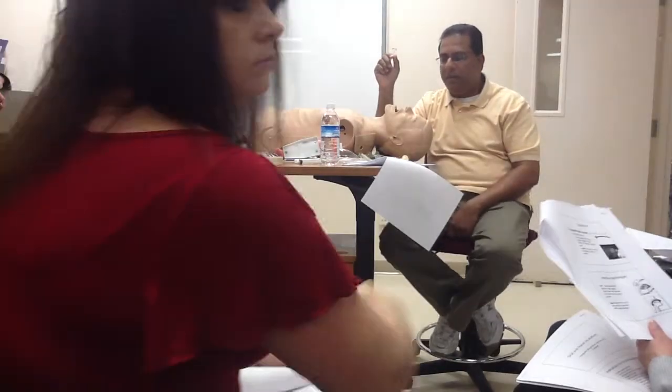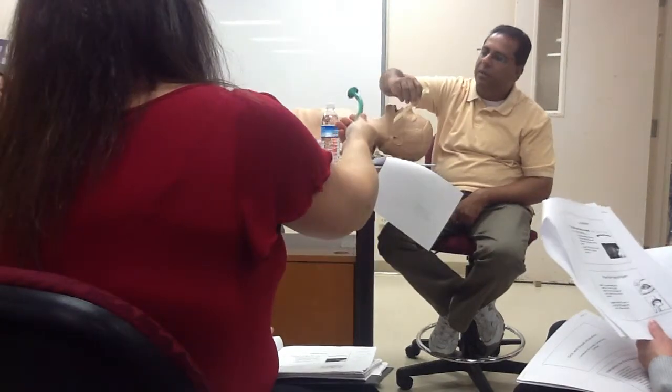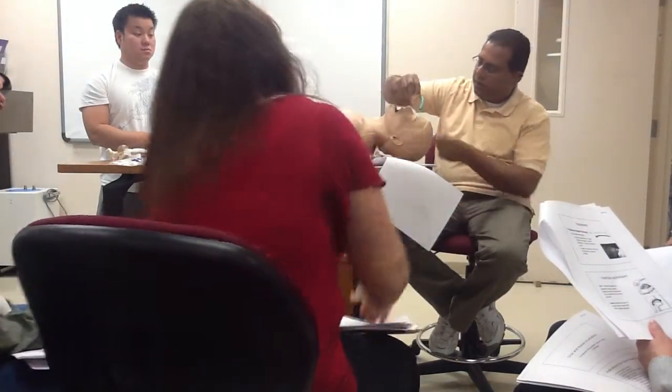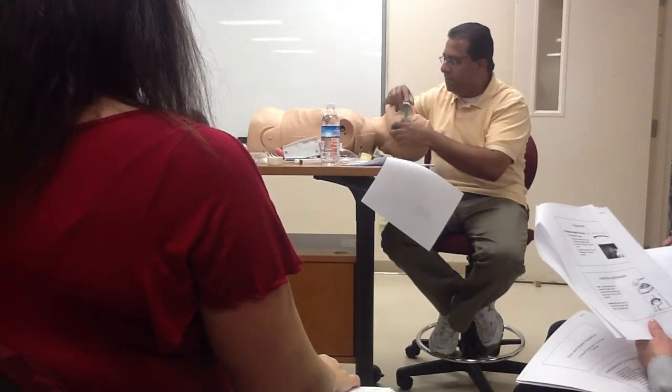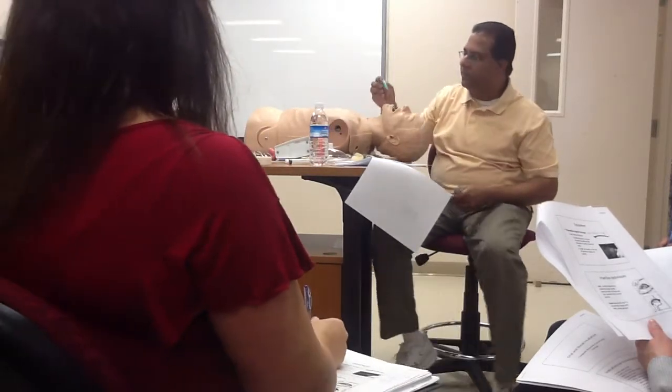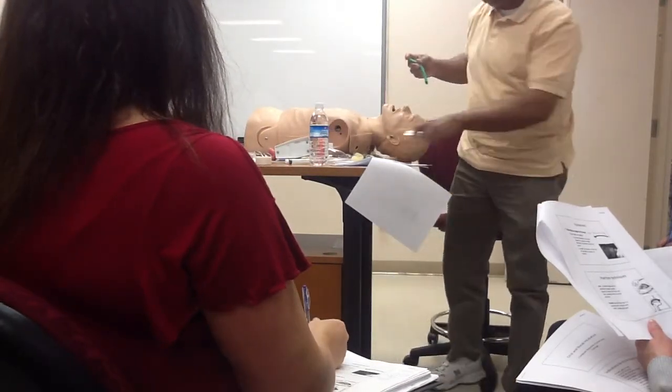Saving their life at that point. Yes, it's gonna hurt either way. The hardest part, I mean, is the size of their nare indicative of the size of their entire nasal passage behind the nare? If you can fit it through there, you can fit it. If there's no deviated septum, if it's big here, it's gonna be big inside too. Yeah.